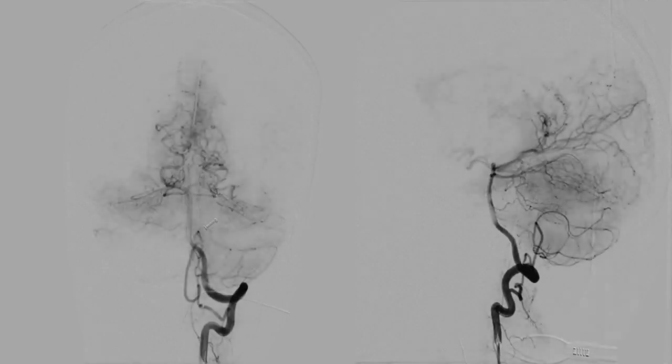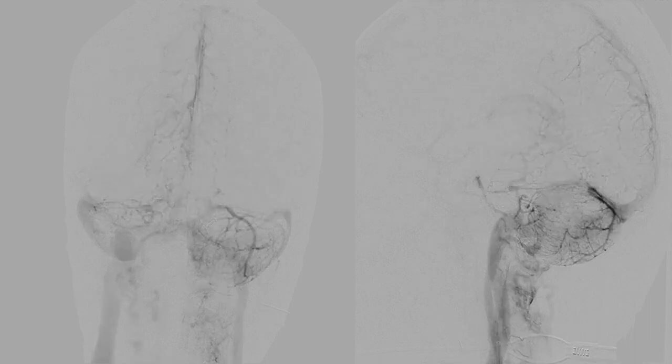For the left vertebral artery, we withdraw the catheter slowly with the tip facing the left side. It automatically hooks the left subclavian artery. We advance the wire in the left vertebral artery, pass the catheter over it, and take biplane DSA.